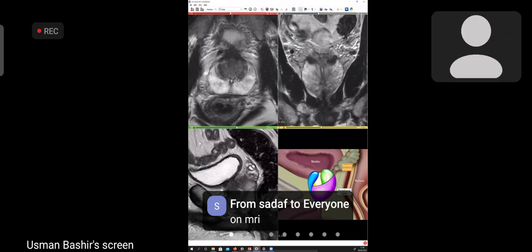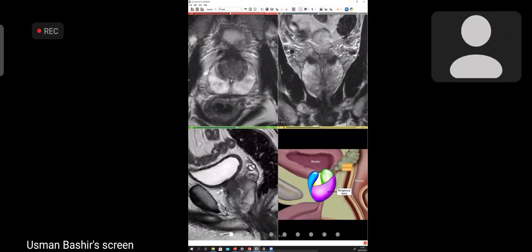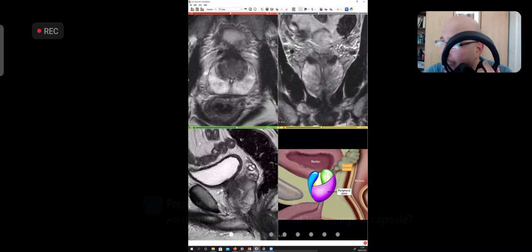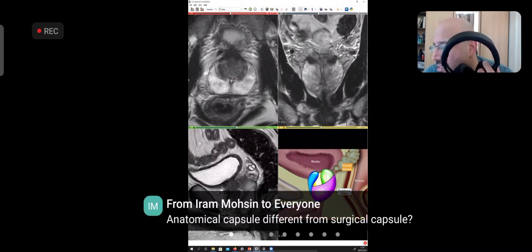Okay. Next question is, what is the criteria to call a prostate enlarged on MRI? Generally, 20 cc and below is going to be small, or a normal size. That's what I would say. In my practice I don't worry too much about enlargement, because if someone has a 30 cc prostate and you think it looks a little bit big, but the person is asymptomatic, you could say mild hypertrophy. If it's 20, you would definitely not call it enlarged. 30 plus, it's reasonable to call it enlarged.